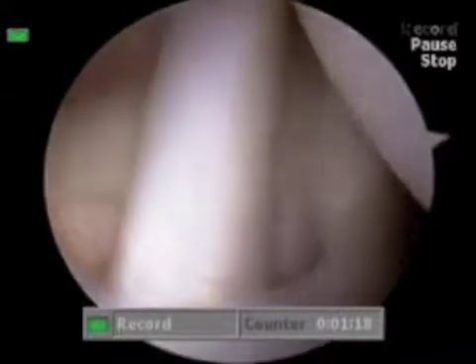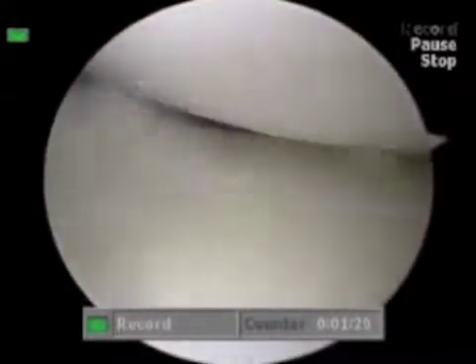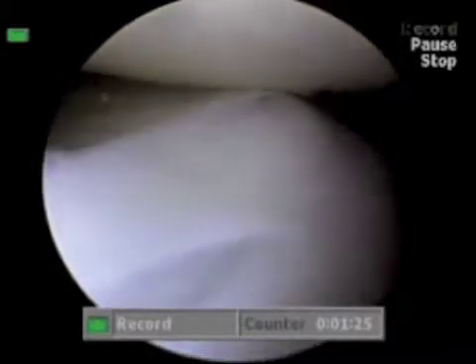Intra-articular pathology usually consists of a patulous rotator interval, a normal labrum, and articulating surfaces, as MDI is a capsular pathology. Chronically, there can be some labral damage, as you can see posteriorly in this case. The drive-through sign is also markedly positive.